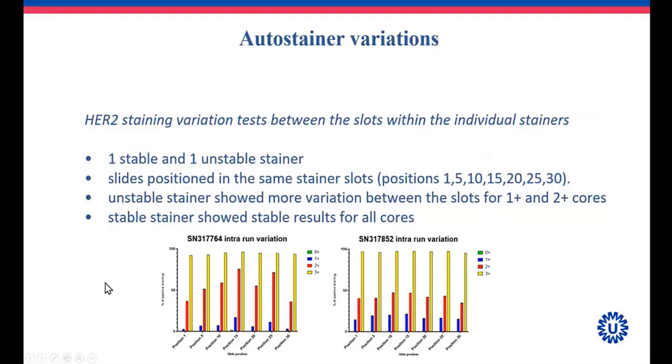The stainer that was previously unstable showed more variation between the slots for the 1+ and the 2+ cores, and the stable stainer showed stable results for all the different cores, as you can see depicted here. So here the red bar, for instance, is much more stable in this intra-run variation, and here it's way too variable for especially the 2+.